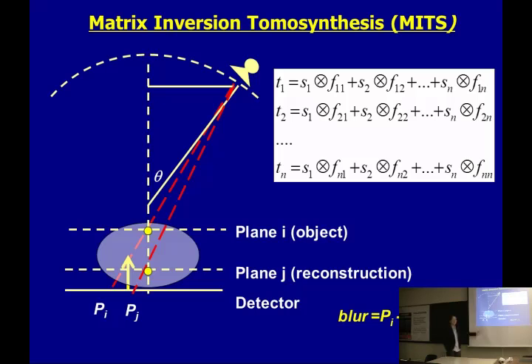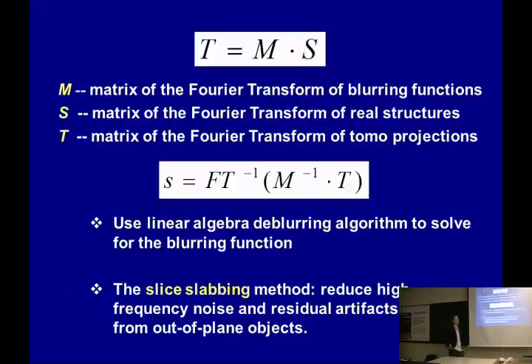And this algorithm actually can be improved as you're working. Because now it's based on a two-dimensional plane, but if you have isocentric motion, the shift will not be just a single line. So we can make it a matrix and do the forward transform, then the inverse transform to go back to the real structure. So this method is basically a matrix inversion technique to reconstruct.